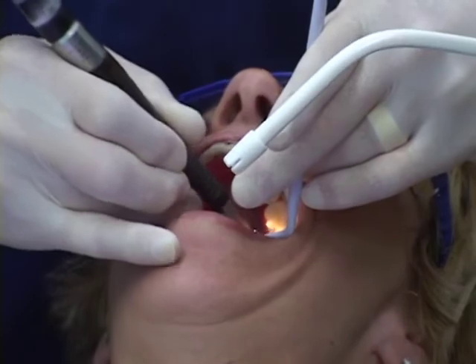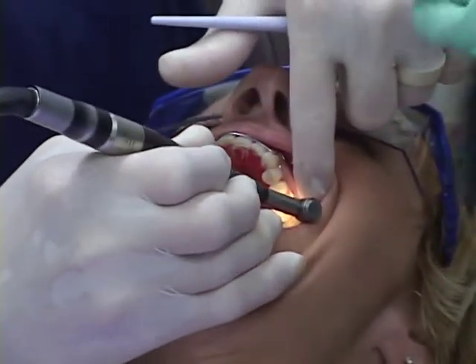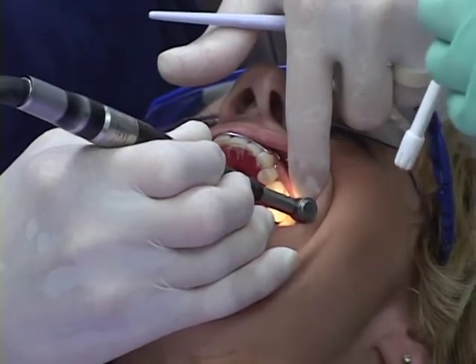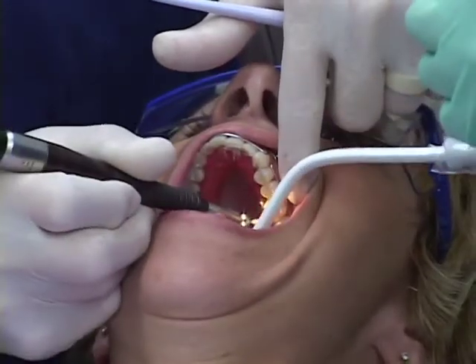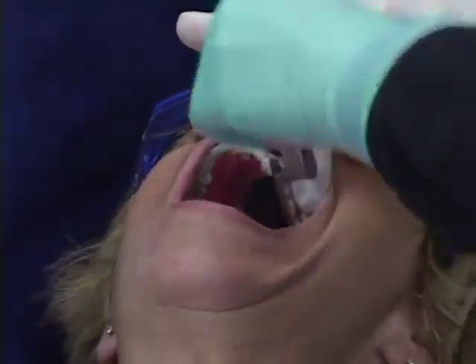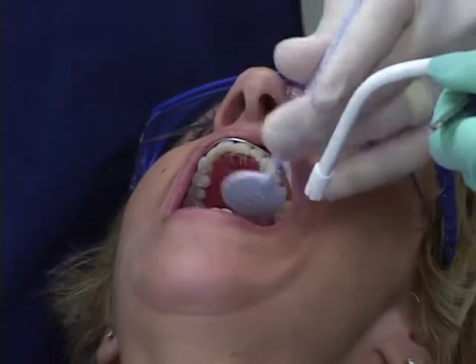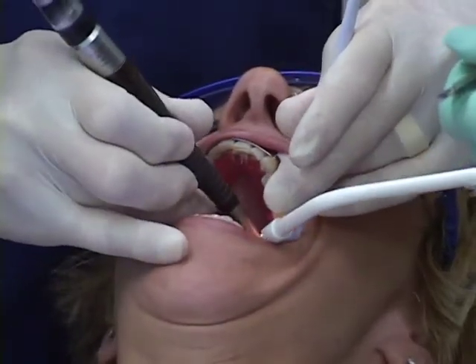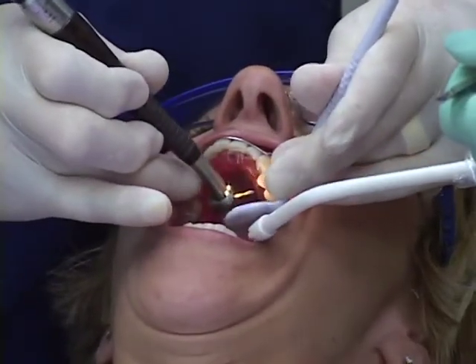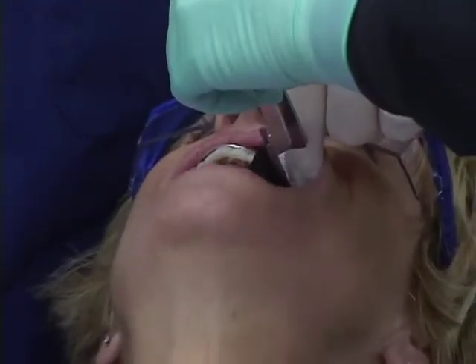Again, same as on the right side, I am only adjusting inclines. I have not touched any cusp tips. Tap. Okay. Good. Tap. Okay.